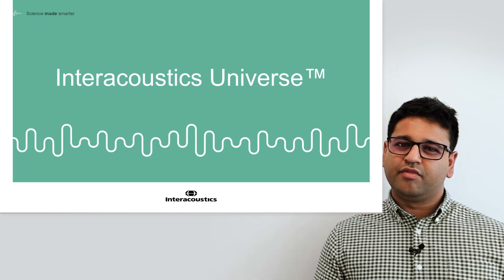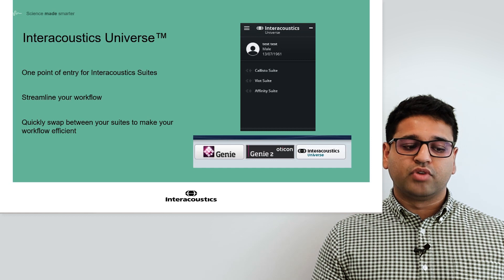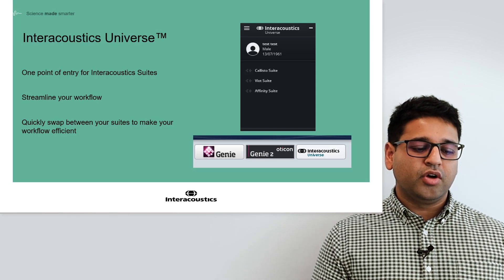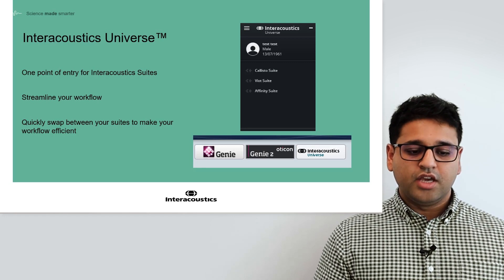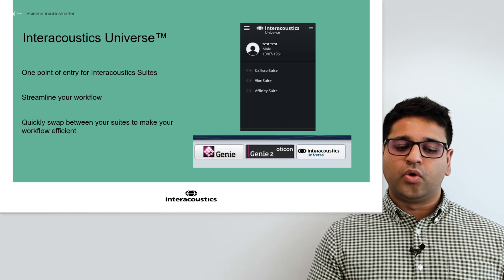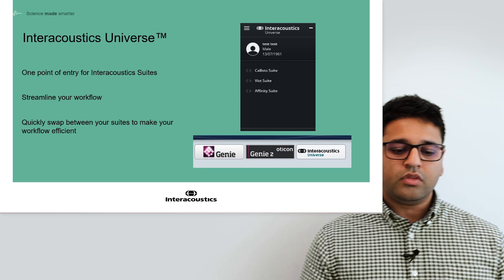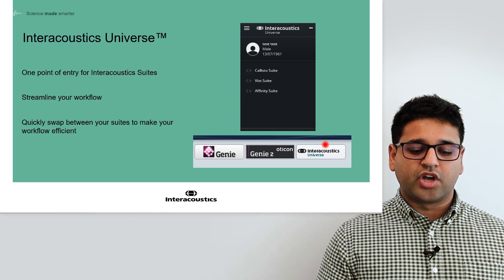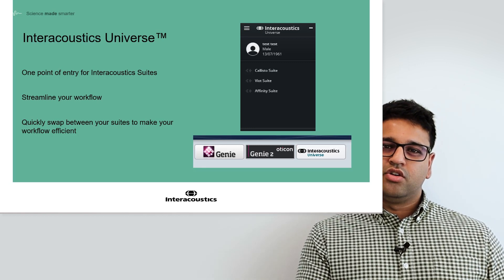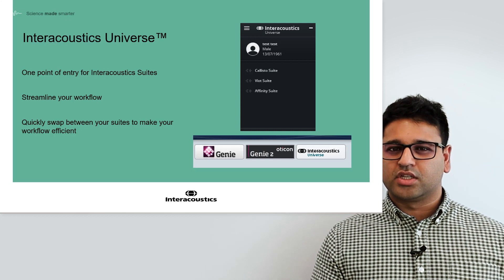I'd now like to introduce Interacoustics Universe — and for this section, this is just a teaser, as I have a more dedicated presentation looking deeper into this software. We're very pleased to release this new software tool, which is a single point of entry for Interacoustics Suites. It helps to streamline your workflow and allows you to quickly swap between suites to make your workflow more efficient. Here you can see the main Interacoustics Universe software screen, which is loaded into your system to launch and control the patient you're working with, enabling quick changes within diagnostic tools, fitting flow, or patient flow. You can also launch it directly from NOAA via its own module, where it acts as a middle point between NOAA and the suites for patient management and faster management of diagnostic tests and data.